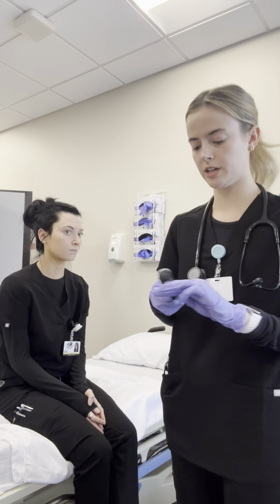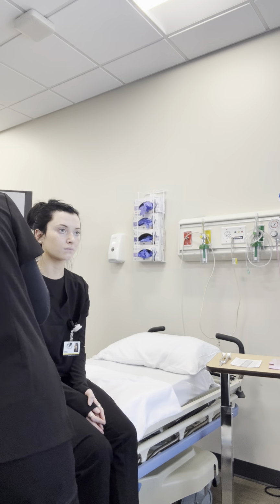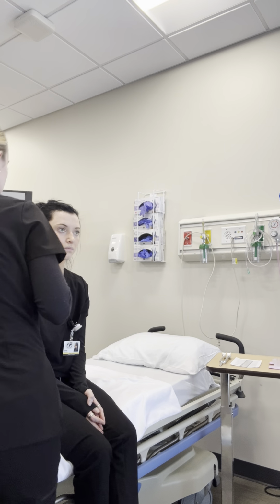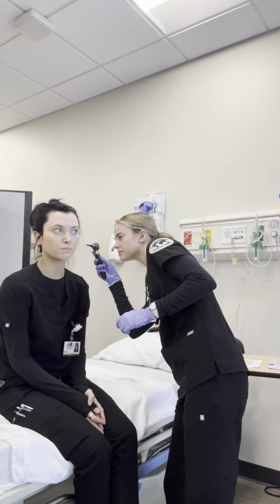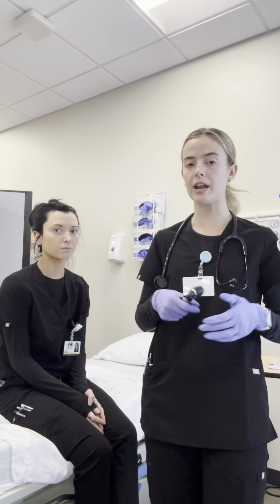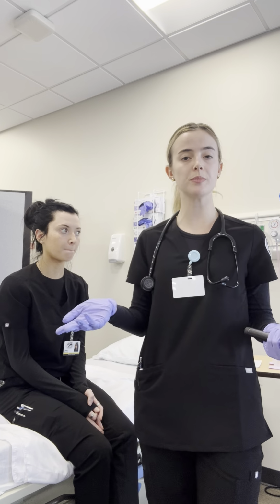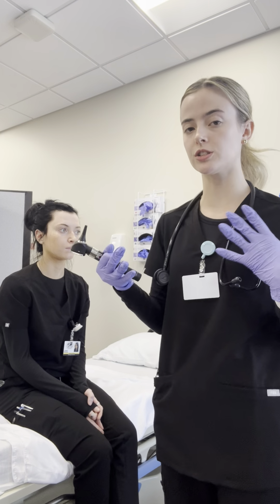Okay, and we're going to be looking inside both ears. Okay, so just looking at the auditory meatus and external canal, there's no foreign bodies, there's no excessive drainage, there's some yellow cerumen, an appropriate amount, and it's moist, but everything looks good there.